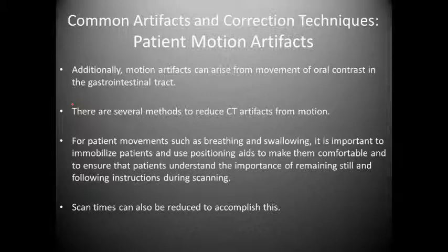For patient movements such as breathing and swallowing, it's important to immobilize the patients and use positioning aids to make them comfortable, and ensure the patient understands the importance of remaining still and following the instructions during scanning. Also, scan times can be reduced so that you eliminate or hopefully reduce the amount of time that the patient can be moving.